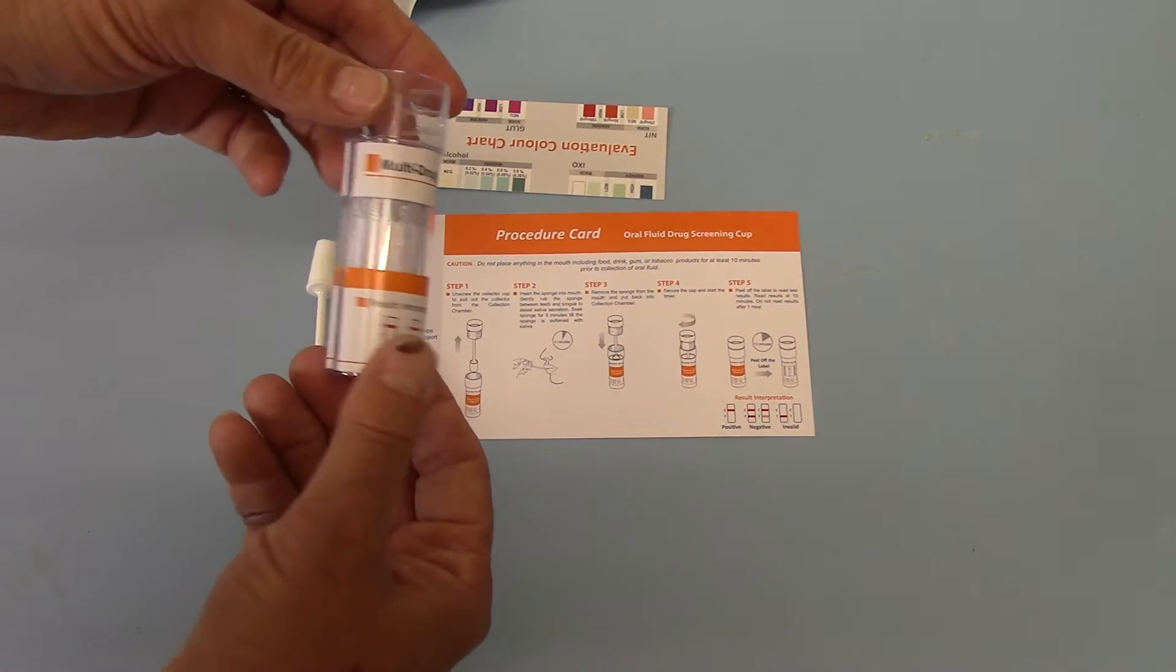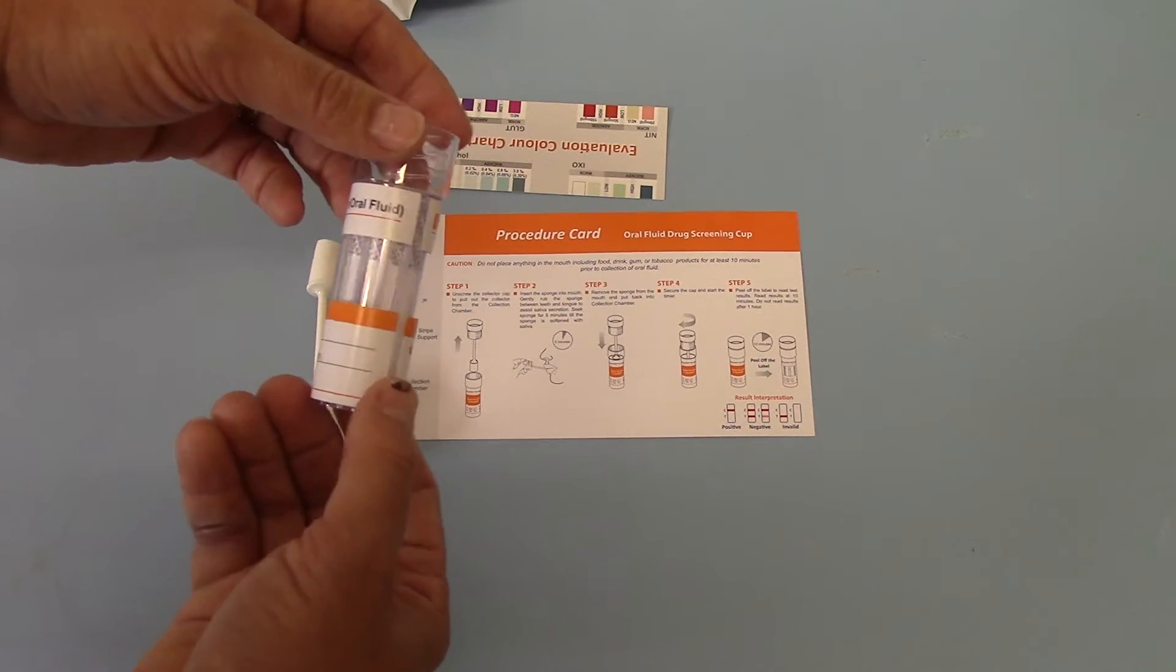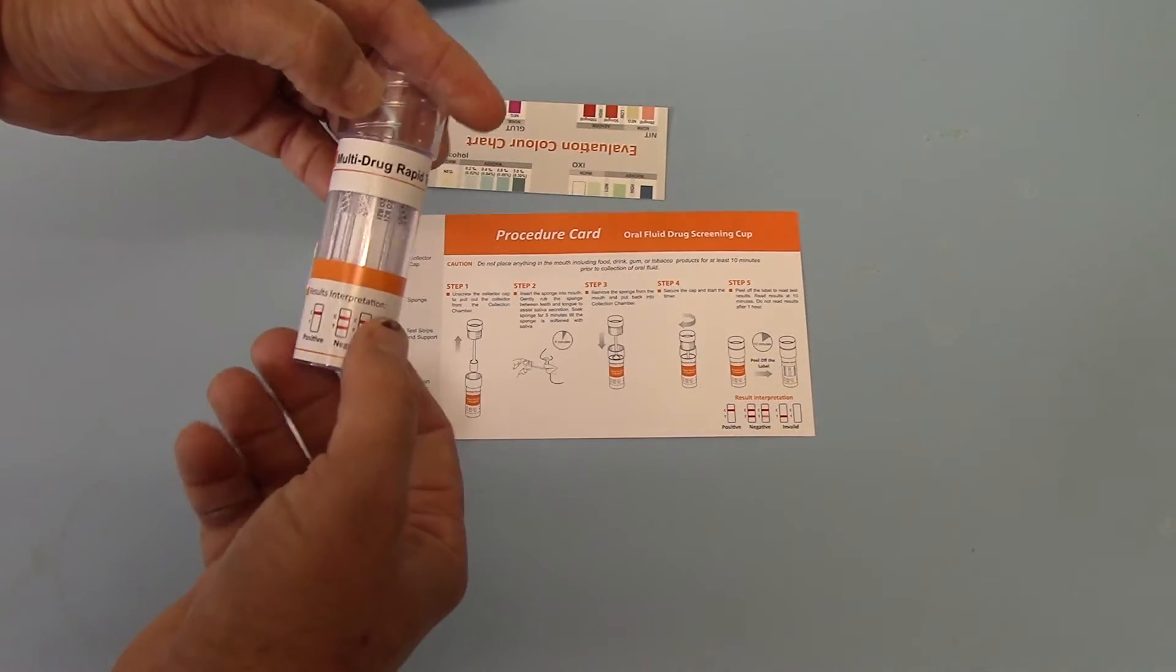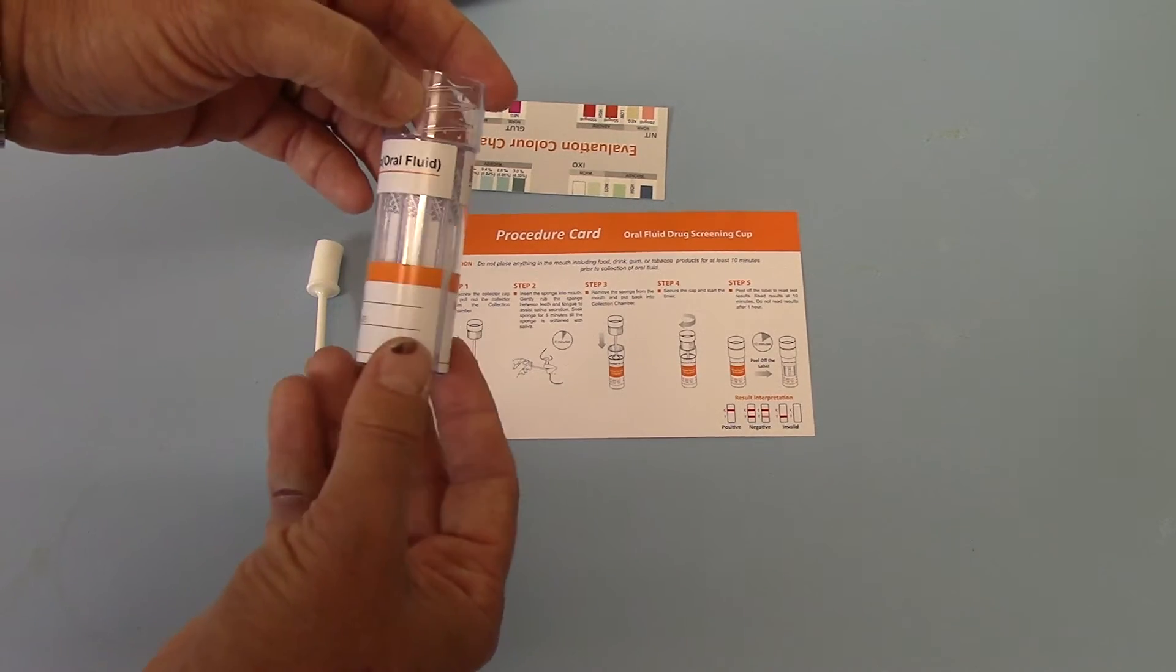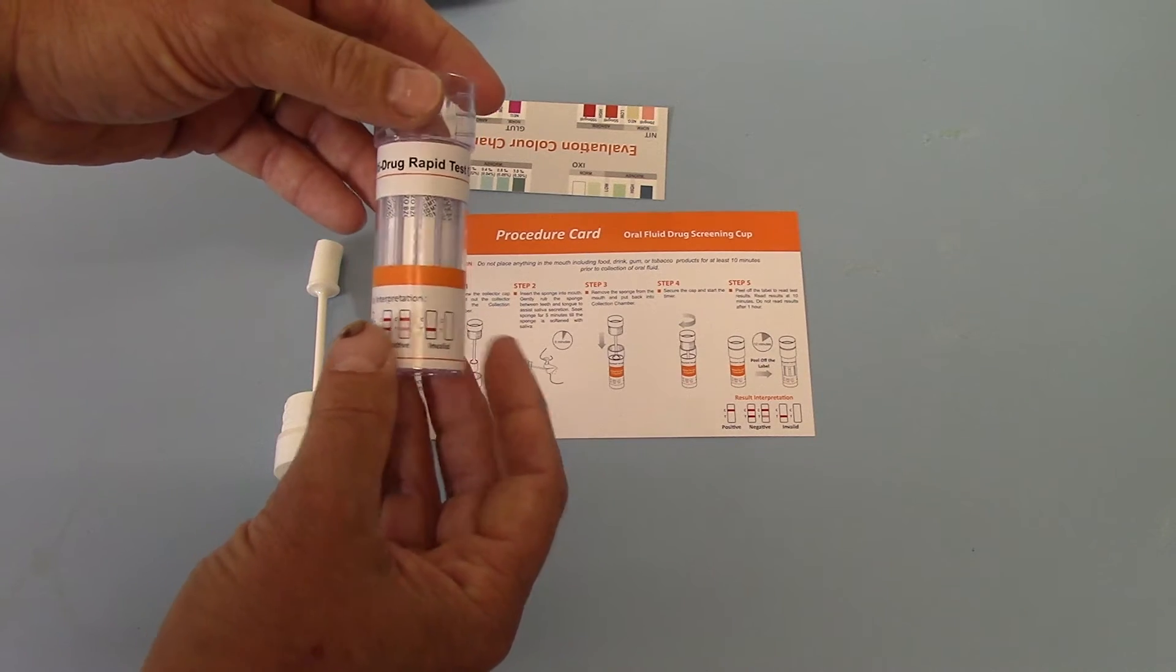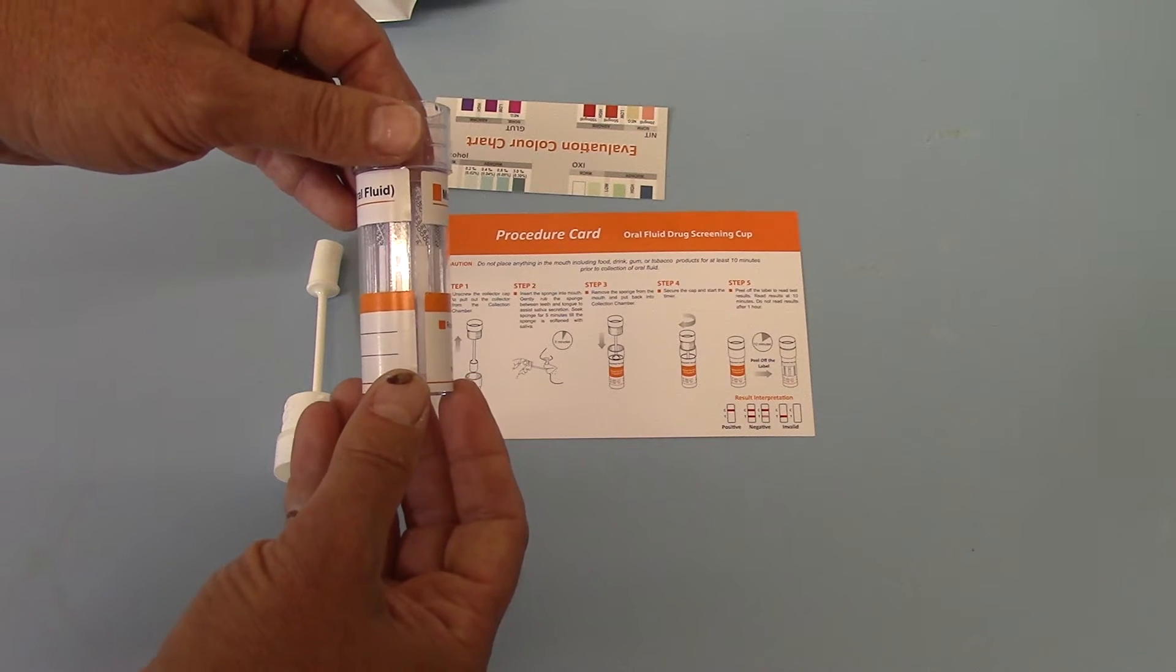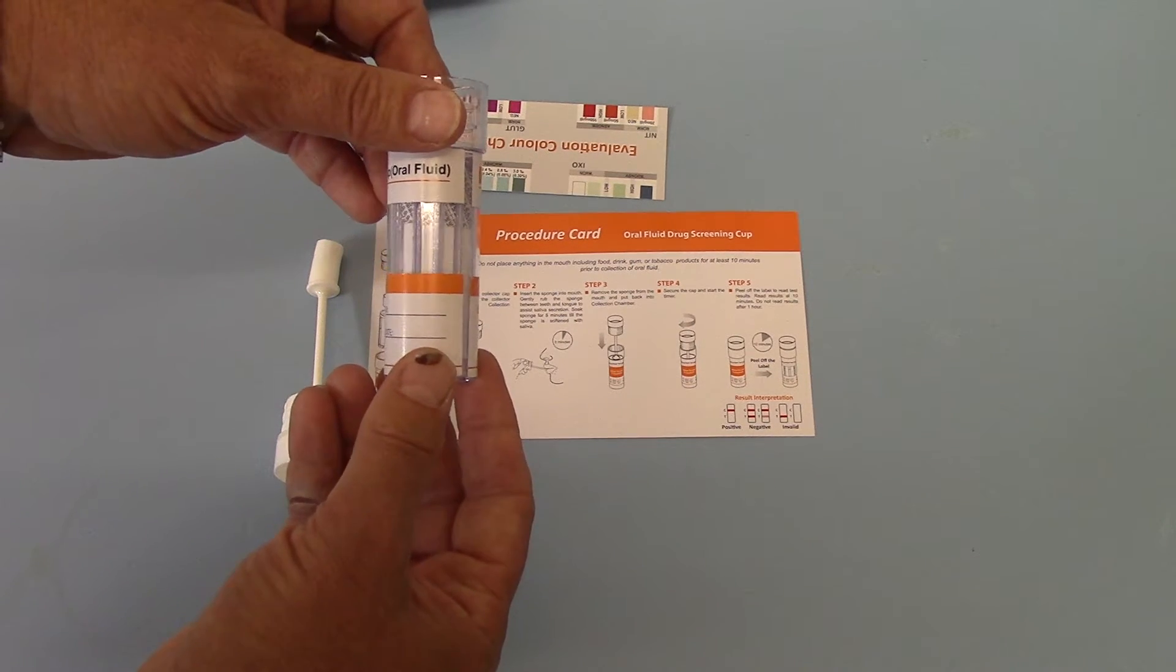For the test results, you will see that around the circumference of the barrel are the 12 test membranes. These have codings on them and the codings on the data sheet relate to the drug abbreviations.